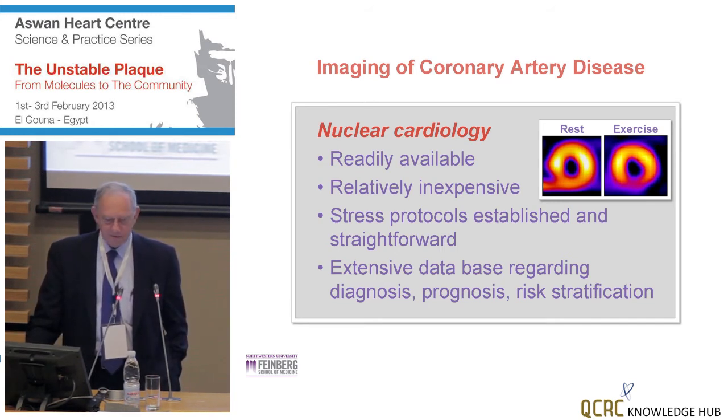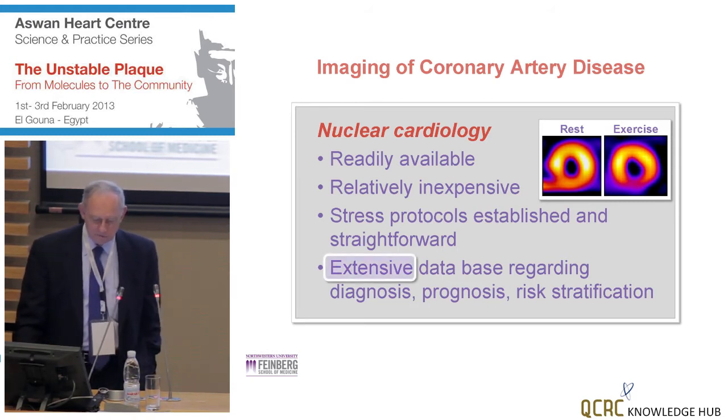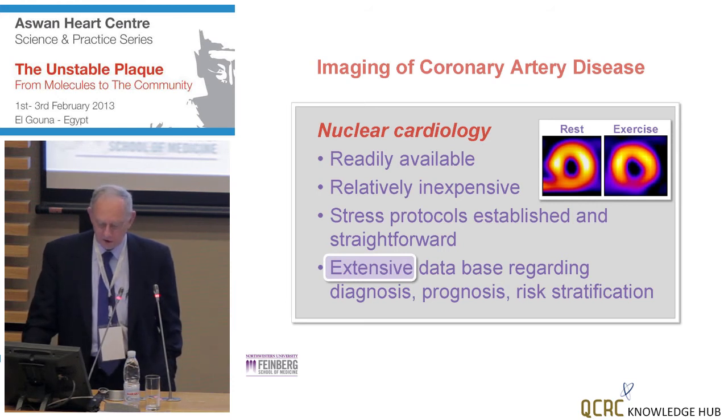Stress protocols are established and straightforward. A very extensive database regarding the prognostic value of these tests as well as their diagnostic value, allowing us to do risk stratification.